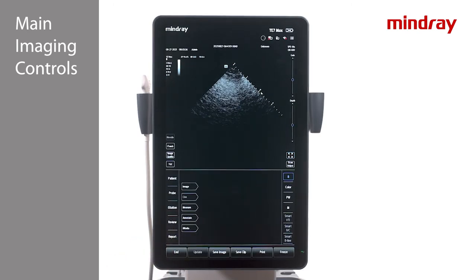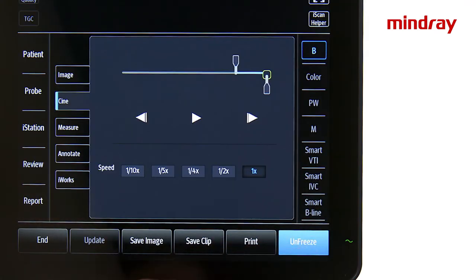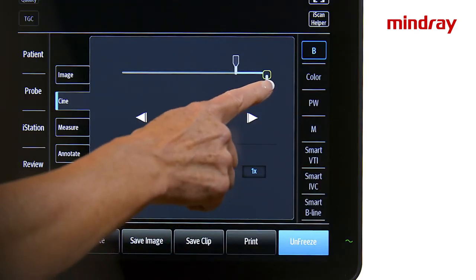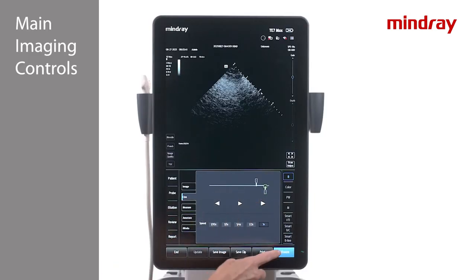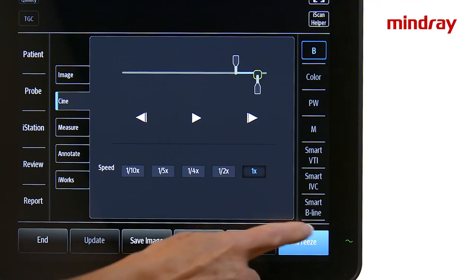The freeze key is located on the lower right side of the touch screen. Use freeze in order to measure, annotate, or print an image. When an image is frozen, there is the ability to cine back to review and save previous frames. To cine through the image, either swipe left on the imaging screen or slide the frame indicator icon under the cine tab to the left. To save an image, press freeze and save image, or save an image on the fly by simply pressing save image without freezing.